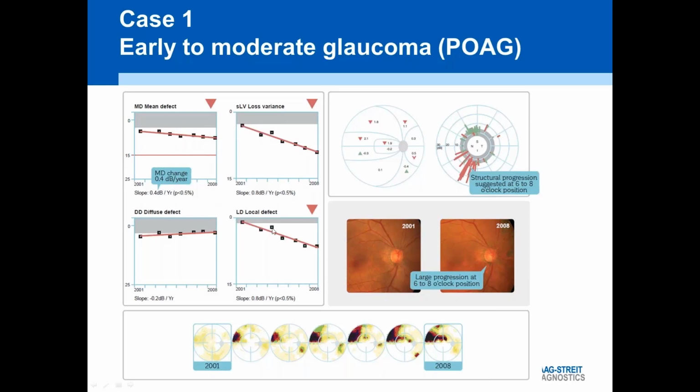Is the change local or diffuse? Clearly local. We see it right here. Where is the change? Mostly superiorly. And where should I look for structural progression? Well, at a 6 to 8 o'clock position, where we see a large progression on the fundus picture that we have here.